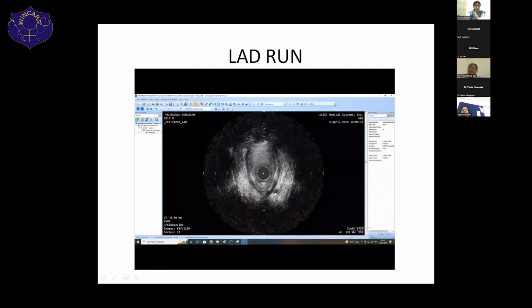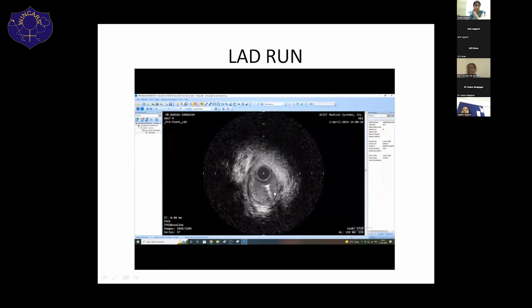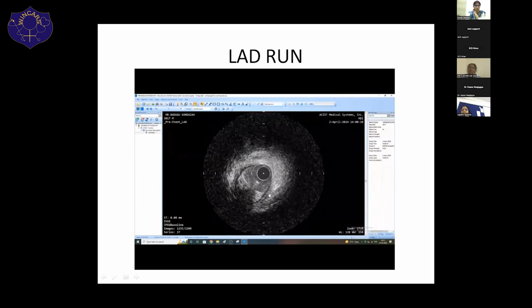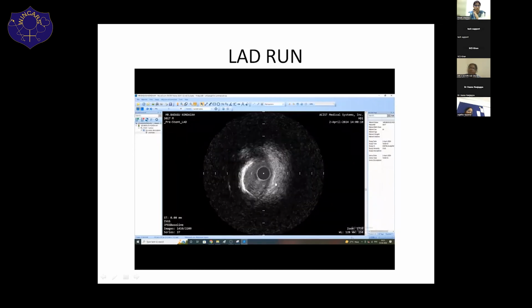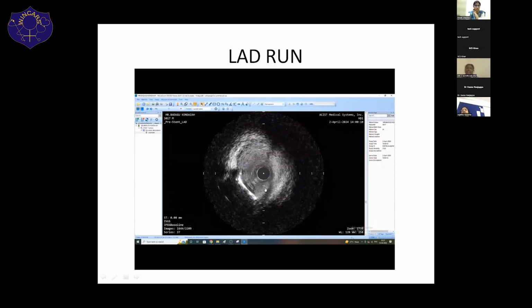Even the diagonal was very close to the lesion. That was also a concern for us in the beginning, because the diagonal might also close, and the diagonal was also big. There were a lot of doubts, because ours is a small center and if something goes wrong, we might not be able to handle that case. After that, we became confident that we could try this case.